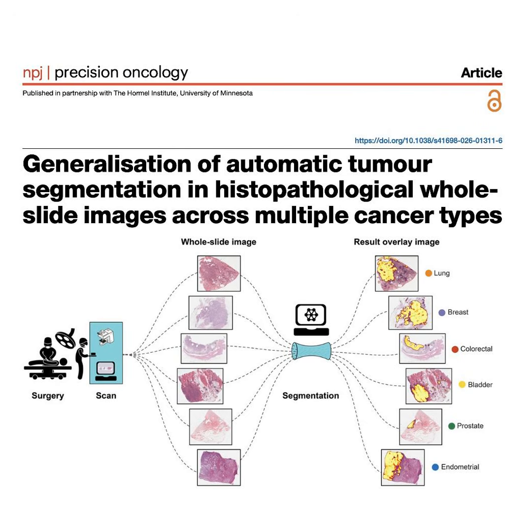If you zoom all the way in on one of these digital slides, you are literally looking at individual structures inside the nucleus of a single cell. So it's an astronomical amount of pixels. I'm assuming no graphics card on Earth can process that entire image at full resolution all at once. Exactly. So the AI first downsamples the image slightly to a working resolution of 1 micrometer per pixel. Okay. But even then, the image is way too vast. So the core mechanism they rely on is tiling. Tiling. Okay, so they chopped the massive slide into a grid of smaller overlapping tiles. Yes, specifically tiles that are exactly 7,680 by 7,680 pixels.